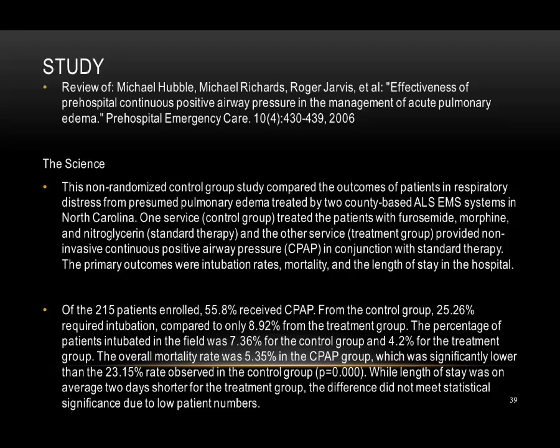CPAP lessens the work of breathing in patients in respiratory distress from all causes and results in fewer intubations and a lower mortality. This has huge ramifications on healthcare costs, as those not intubated are less likely to require ICU admissions. Pre-hospital CPAP reduces the need for intubation and places the patient into a continuum of care that can be continued after admission. The role of Lasix and morphine has been previously evaluated with some studies showing that the inappropriate administration of these drugs to patients who don't have pulmonary edema increases their length of stay and mortality rates. The bottom line? CPAP is for everyone.